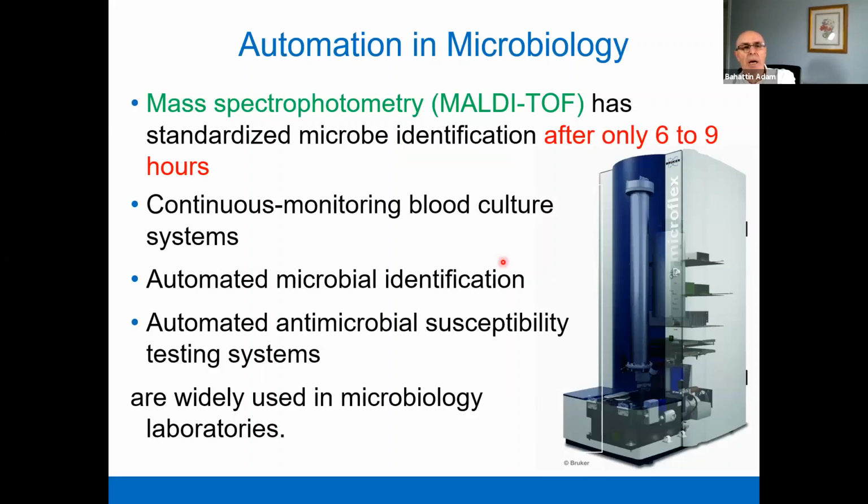Okay, automation in microbiology, the last part of the microbiology that I want to share with you. We like automation, right? Because it reduces the rate of errors.